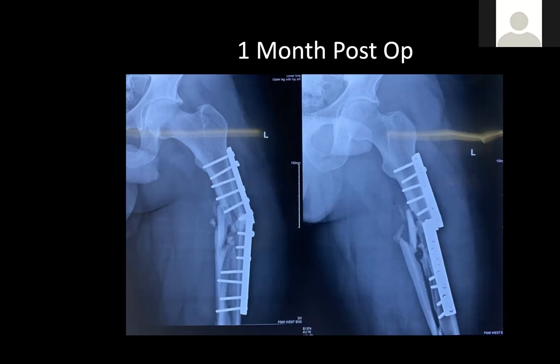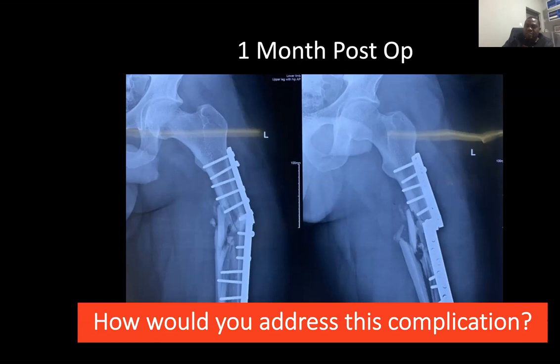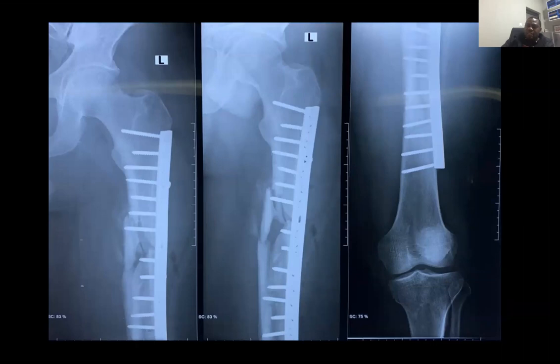Okay, I think the discussion is almost over. We are in agreement. So you've answered that. How do you address this complication? And my good colleague went in, revised, and put a longer plate, agreeing with John. He agrees with John that you can put a very long plate and it will work.